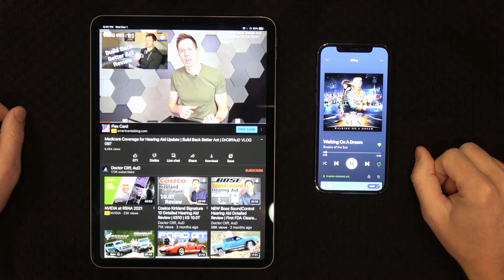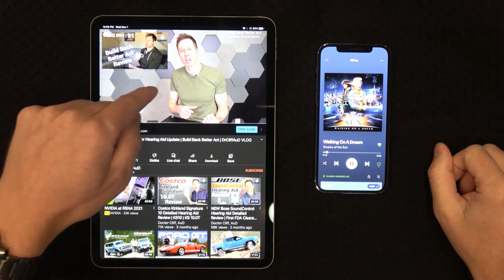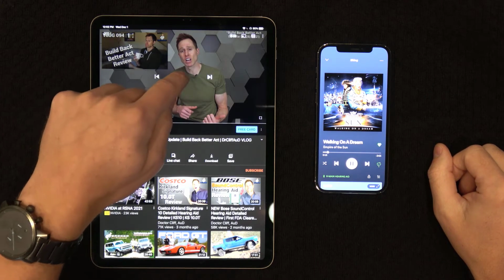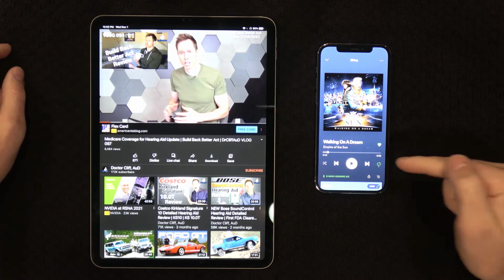When you are done with your walk and want to resume streaming audio from the YouTube video that you just paused, simply press the play button on YouTube on the iPad and you'll start hearing the video again, thus automatically pausing the music from your phone.